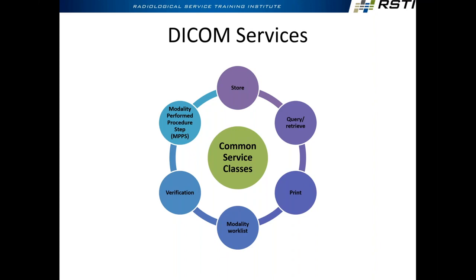Jane Doe, John Doe, procedure information, CPT codes, all the stuff they would need for scheduling and for billing. Well, that's stored in the central server. It's not pushed out to all these modalities. Modalities have to request it. They may auto do that every 15 minutes or 10 minutes, but still request. Refresh every 15, you know what I mean?